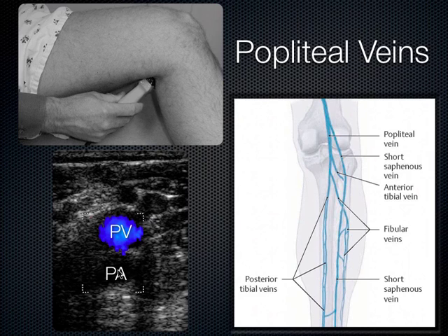Now, if you look this image up in Netter, Frank draws it sort of left and right, medial lateral to each other, whereas I see it more realistically anterior posterior or posterior anterior to each other. So it's not this side-by-side thing the way he tries to make it seem. Sometimes it's that way. Normally, though, I see it very posterior anterior. Okay?